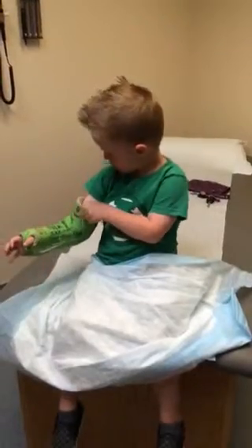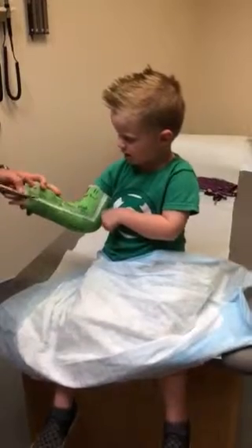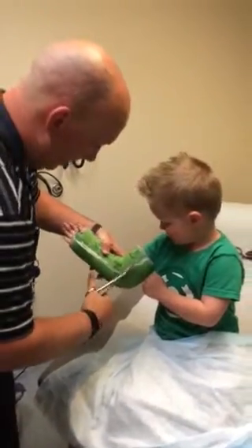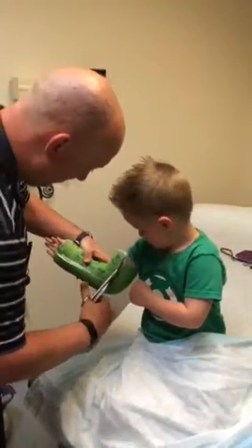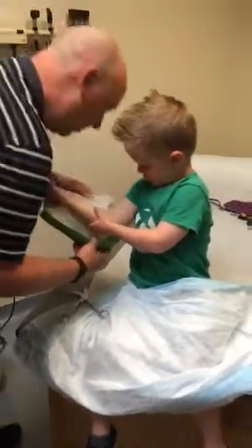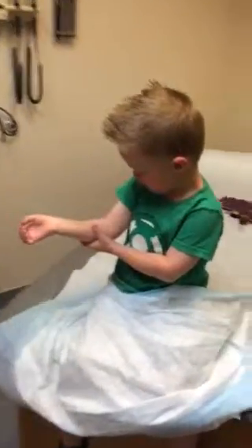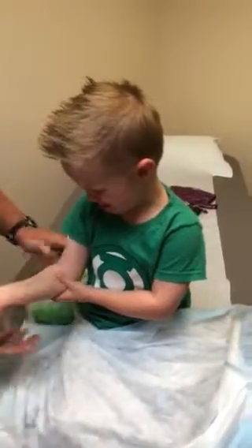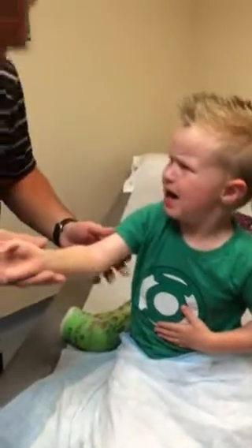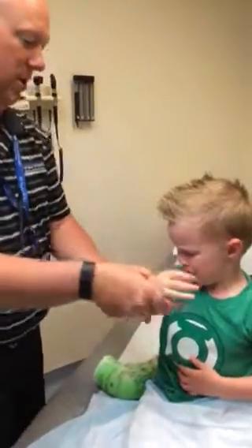Now we've got to do the other cool magic trick — cut the cut. It's not going to cut my arm. You know what? I wouldn't do that to you today. You want to know what's special about today? Today's my birthday! Wait — I didn't tell you my awesome trick. This muscle's a little sore, buddy, it's going to be okay. Let's not straighten it up, just hold it right here. Mom's going to wash your arm, okay?